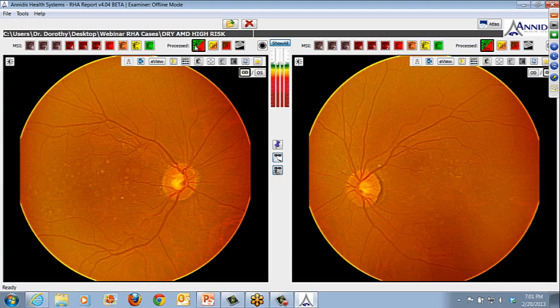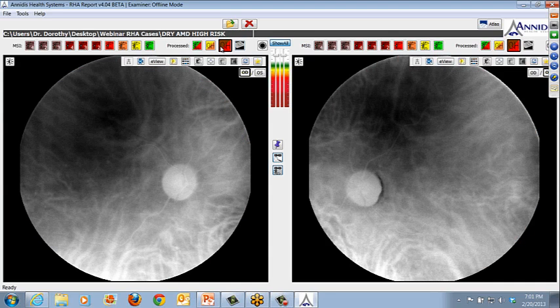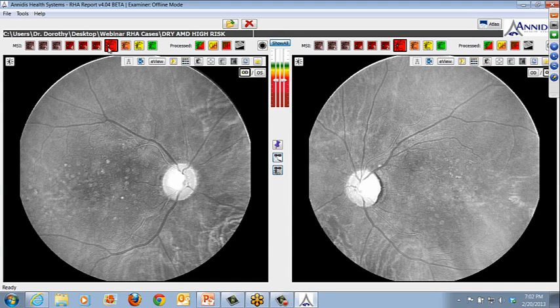Okay, but having said that, if you have OCT, honestly, this is a patient. If you have any metamorphopsia, you have even one single tiny little blot heme anywhere in that posterior pole near the macula, you should presume that there is a neovascular membrane until proven otherwise. And this is the type of patient you want to drive to your OCT. Okay, even a baseline is fine. But again, you can image these areas, and you can image the large drusen, and you'll get good at looking at these images and determining that in fact there's no concerning PED or other exudative lesion there.